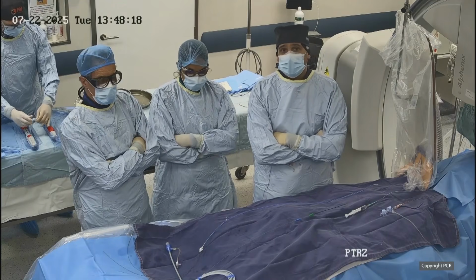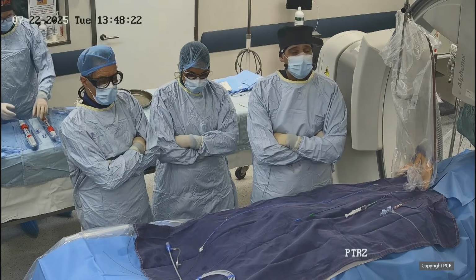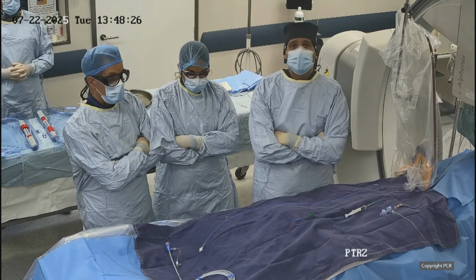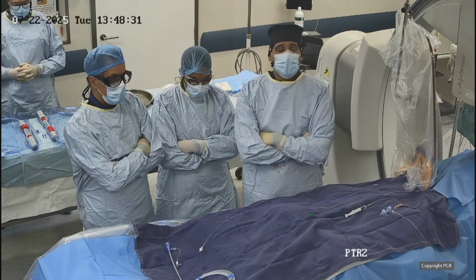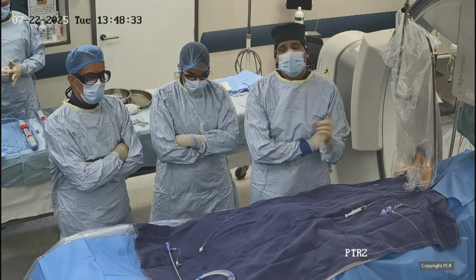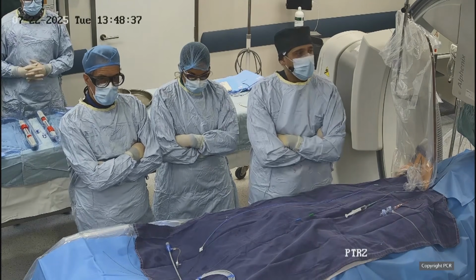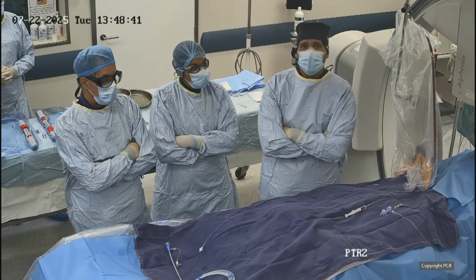TricValve done without contrast. We are going to guide the procedure by echo, and one reference in the pulmonary artery is going to be a pigtail, and while deploying the inferior vena cava system, we are going to have two catheters in both hepatic veins. So we are going to guide the procedure without any contrast.